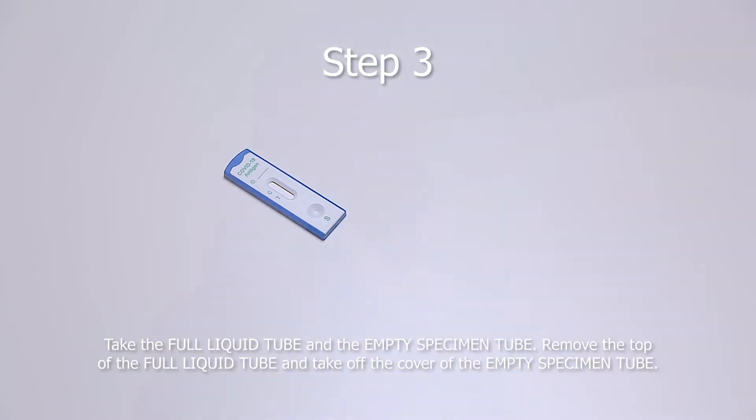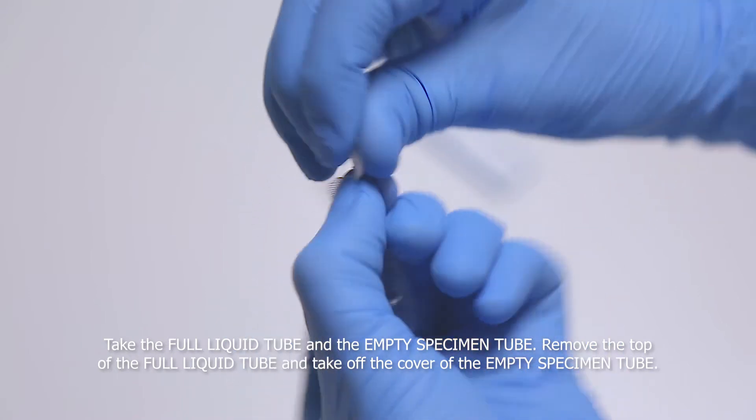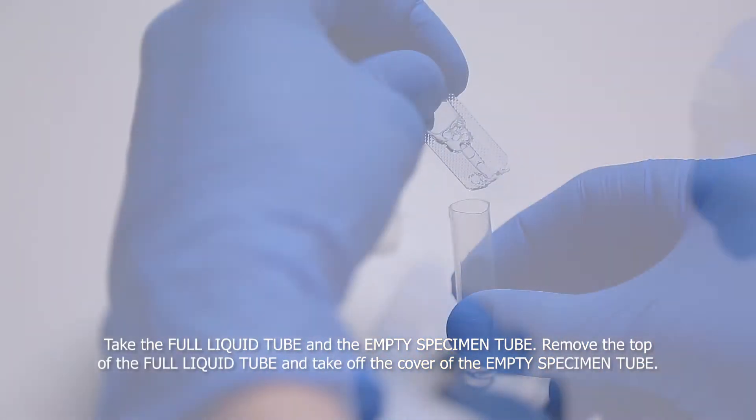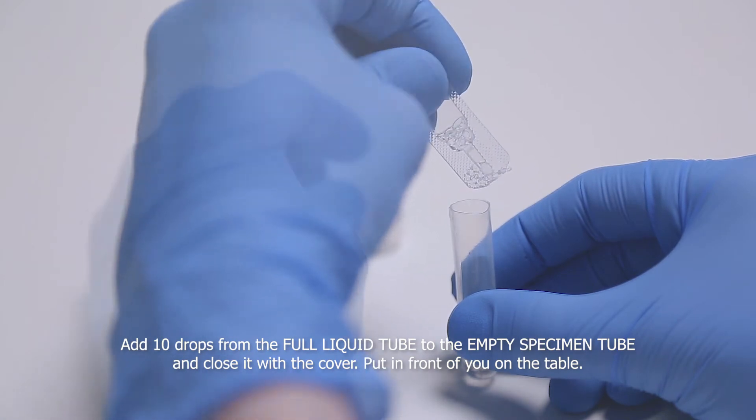Step 3. Take the full liquid tube and the empty specimen tube, remove the top of the full liquid tube and take off the cover of the empty specimen tube. Add 10 drops from the full liquid tube to the empty specimen tube and close it with the cover.